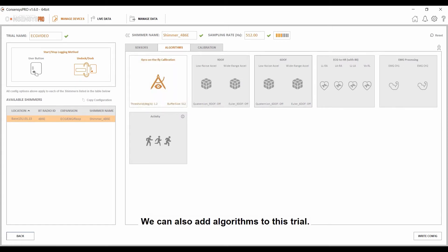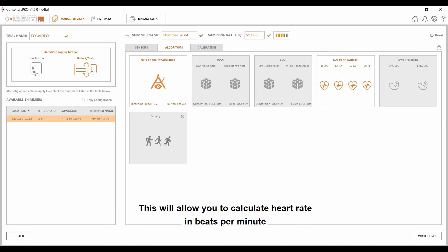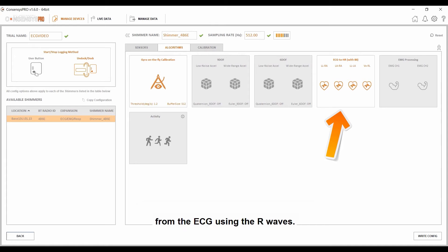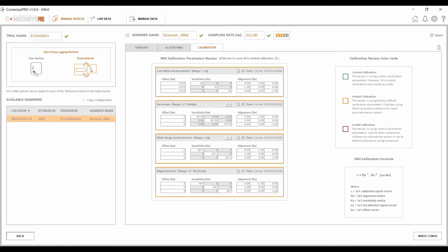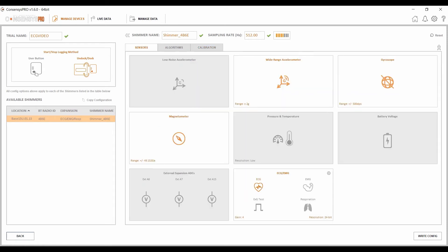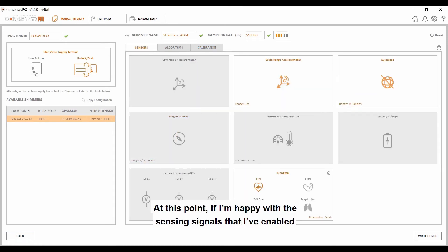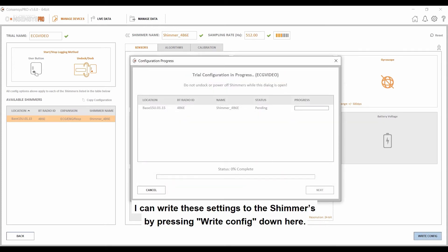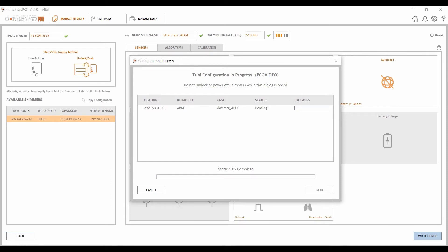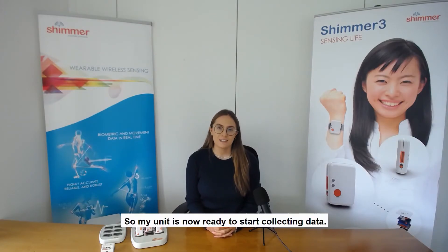We can also add algorithms to this trial. Here you can see the ECG to heart rate algorithm, which will allow you to calculate heart rate in beats per minute from the ECG using the R waves. This algorithm can be applied to live or logged data — in this case, we'll be applying it to the live data. The final tab to consider is our calibration settings. If I'm happy with the sensing signals enabled and the various other settings, I can write these settings to the Shimmer by pressing Write Config.